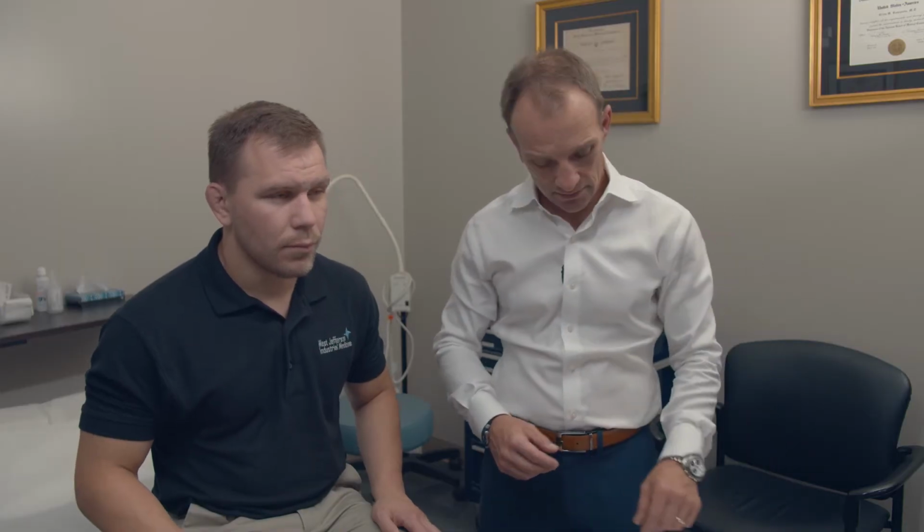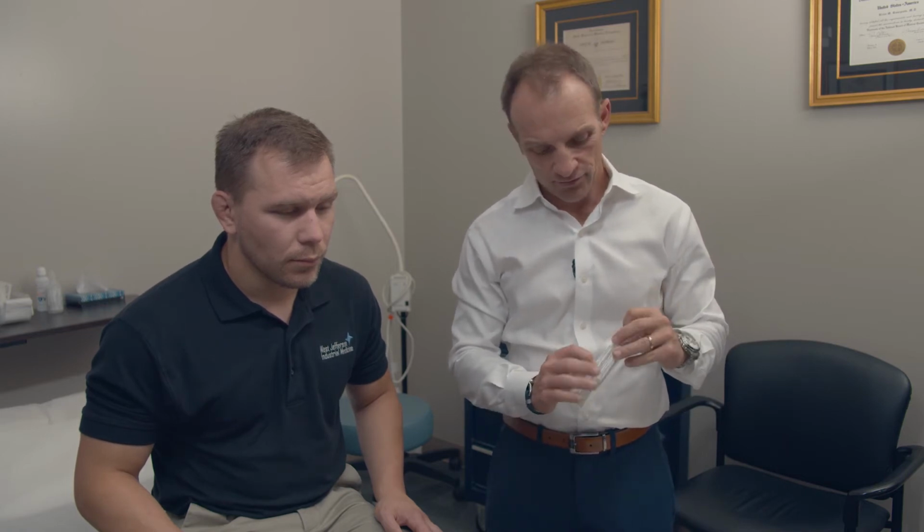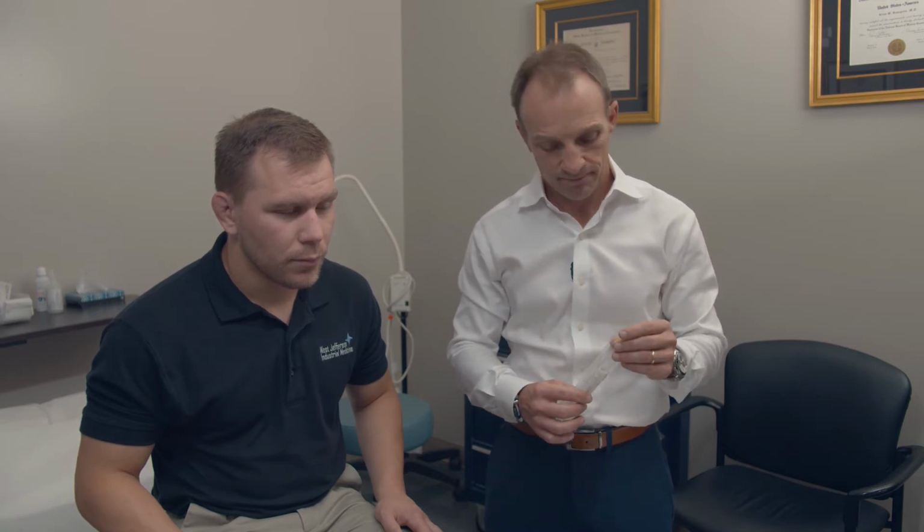Once that's done, we're going to then address the test kit. The test kit has two items in it. It has a swab and a collection container. The swab, if you notice, is longer than the container. It has a red mark, which is going to be the break point, and we'll show that during the specimen collection.